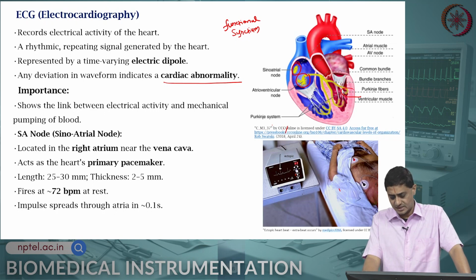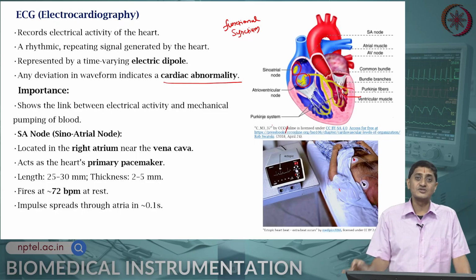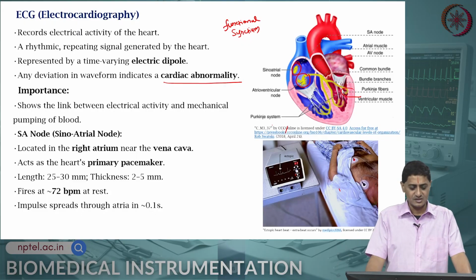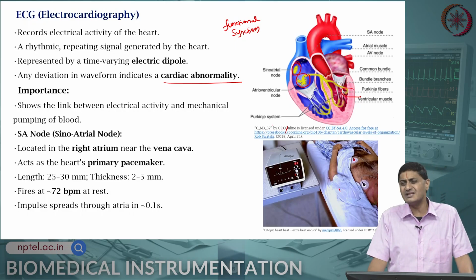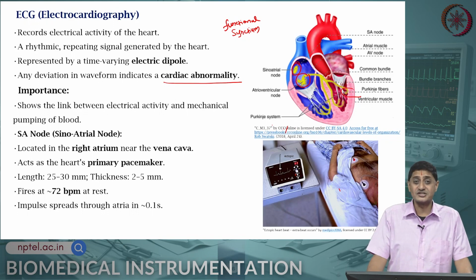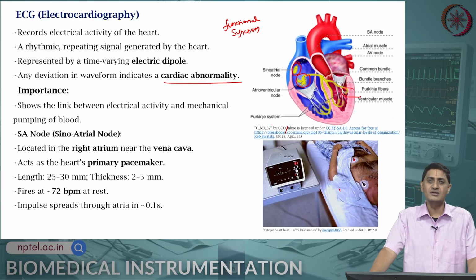So, if you are interested in building a medical device, you need to keep a device such as the ECG system as your benchmark for scale. Such is the scale at which this is deployed, because it turns out that even primary care physicians can read ECG and can detect abnormalities. Of course, maybe they will not treat patients who show abnormalities, but they will refer them to the cardiologist. Now, it turns out that it's that prevalent and that widely adopted. So, this is one of the most successful medical instruments.